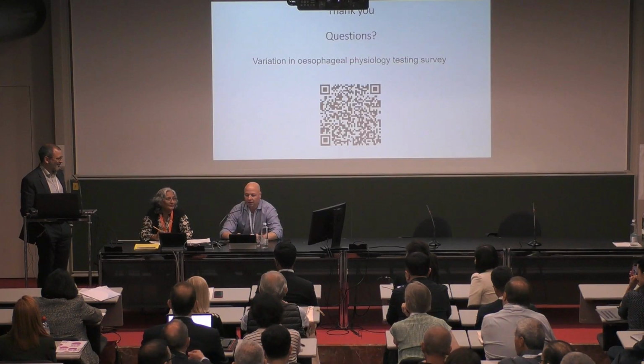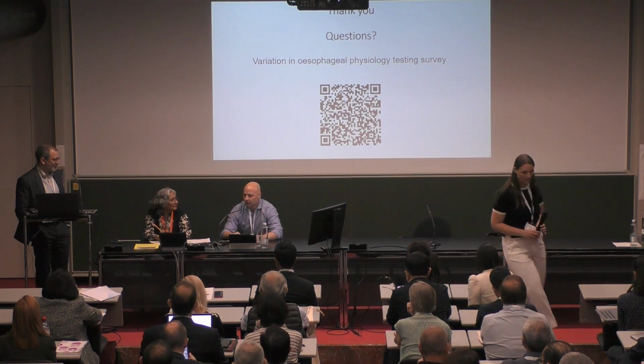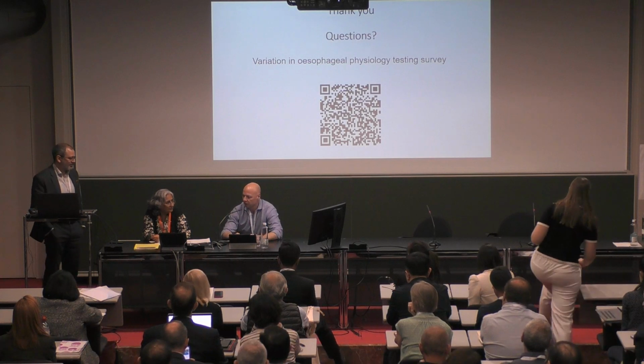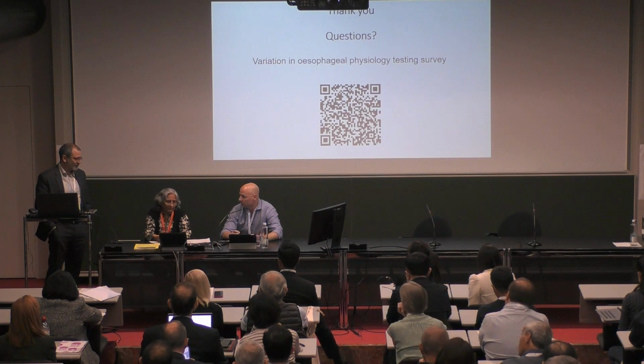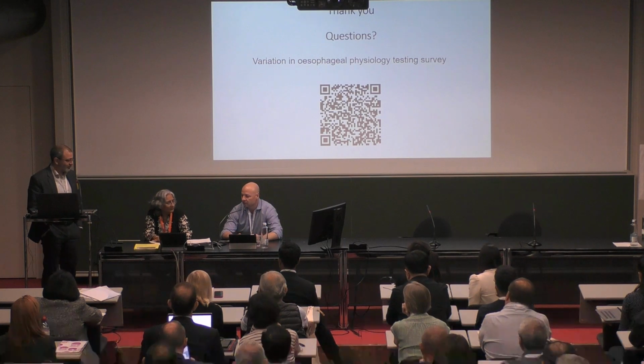Rami, great talk. I'll take the liberty of asking a question. I totally agree with you. I think the diagnosis of IEM has really been overdiagnosed, and what you need to do if you really want to see if the esophagus is defective is to stress it. That can be done with a solid test meal or even a FLIP. I mean, FLIP is a stress test of the esophagus.